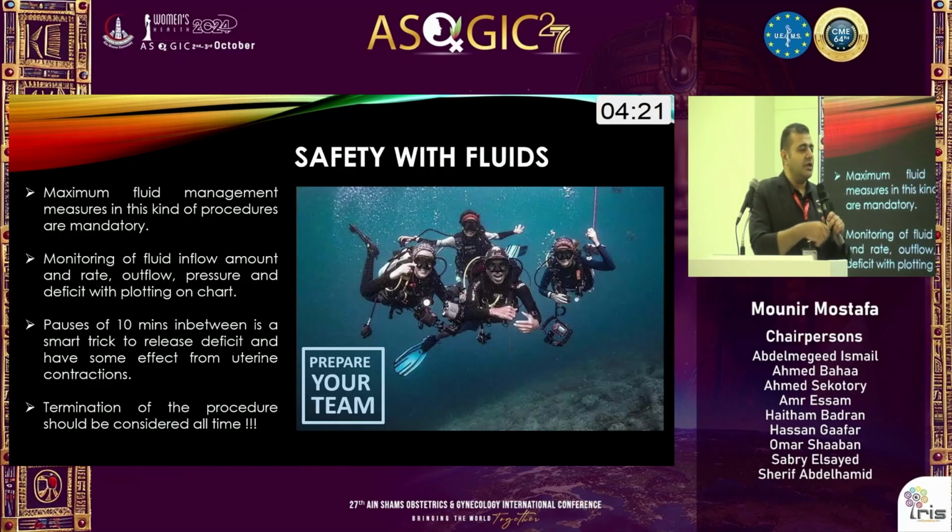You cease the operation, you take off the gloves, you turn off the devices. During these 10 minutes, maybe you give diuretics, you insert a urinary catheter, you measure the amount of fluid out, and you subtract this from the deficit. From 65 to 80% of the deficit can be decreased during these 10 minutes. In this kind of operation, this will give you another benefit: you can make some uterine massage, give methergine, and more myoma will be pushed inside the cavity.